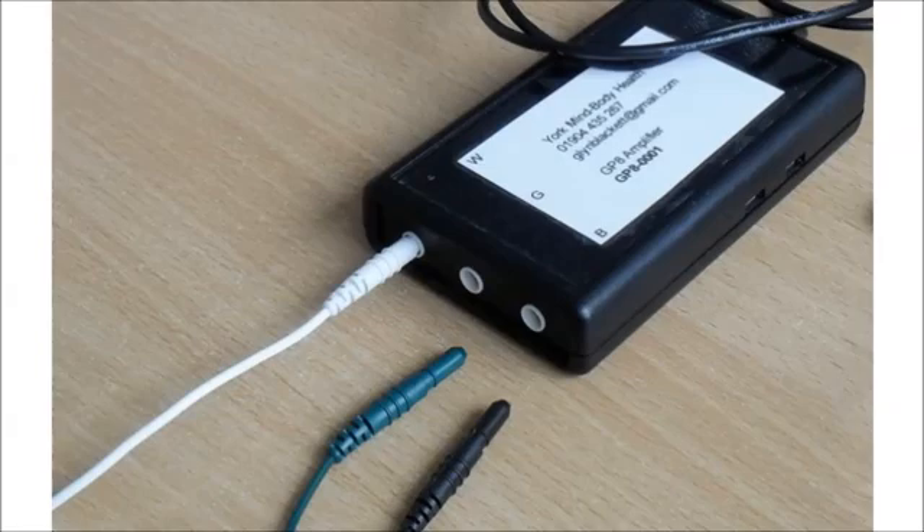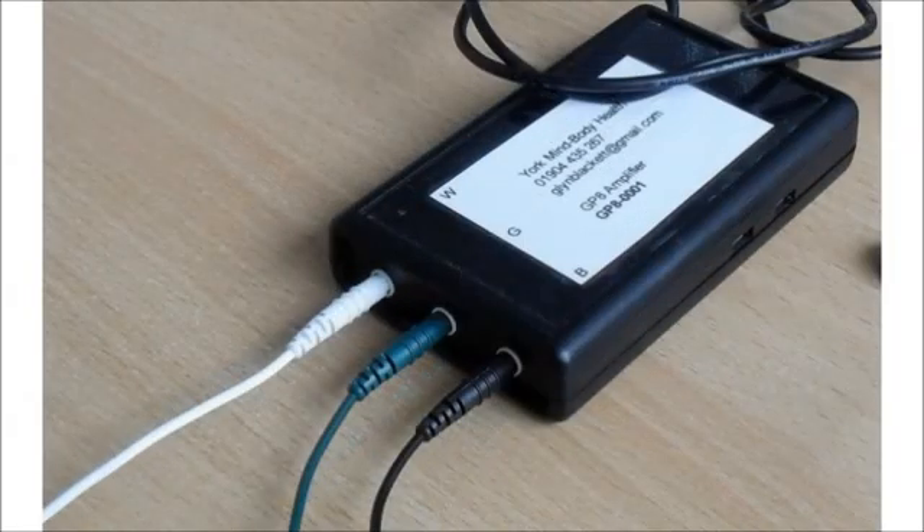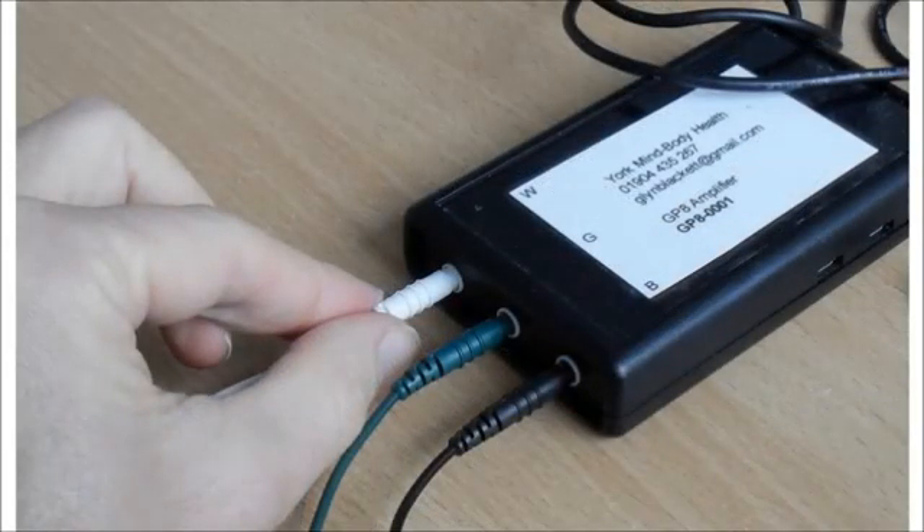The three cables plug into the front of the GP8 device like this. On my rental devices I've labeled the sockets W, G, and B for white, green, and black. Just a word about care of the sensor cables because it is possible to damage them. Never pull on the wire part when disconnecting them either from the skin or from the amplifier — instead always take hold of the plastic casing at either end. Never bend the cable too sharply, for example when coiling them up, because kinks will adversely affect the signal. Don't wrap them around the amplifier box.